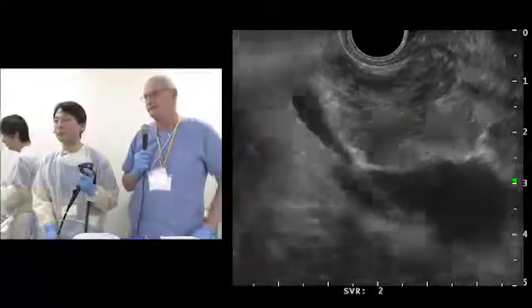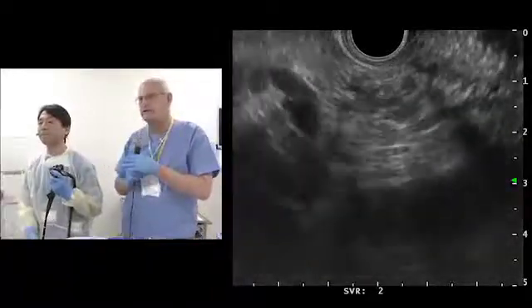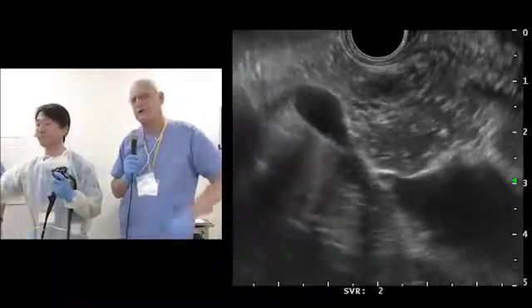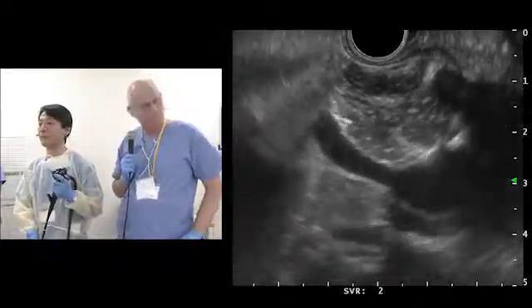Yes, I would recommend without suction. As long as you make good passes through the tissue in different trajectories, there is no need for suction. Suction produces a lot of blood, and this dilutes out the cells needed for making an interpretation. Do you have any tips for fanning technique?